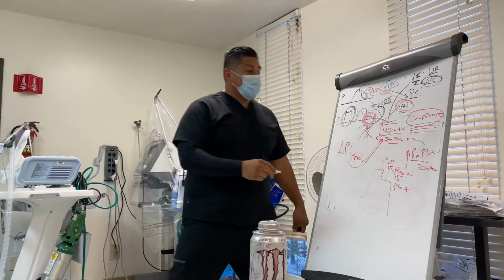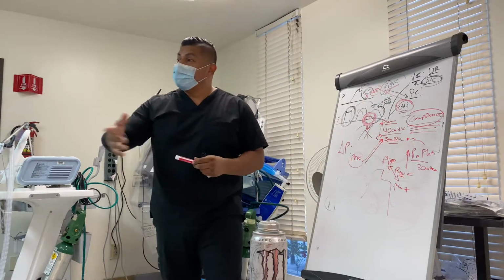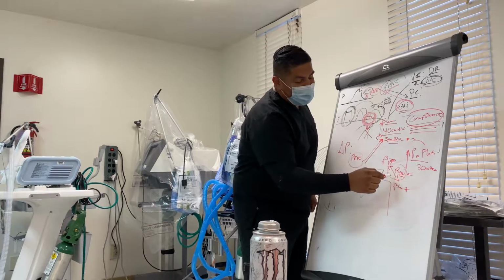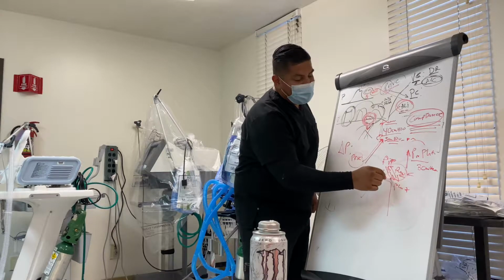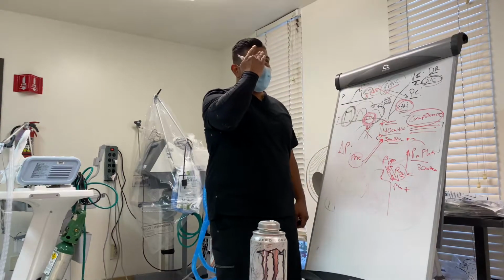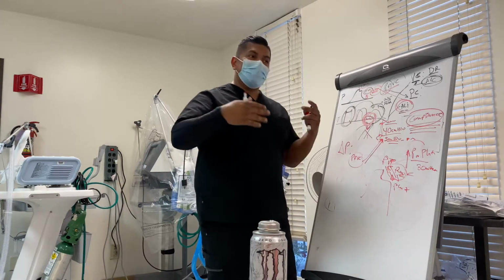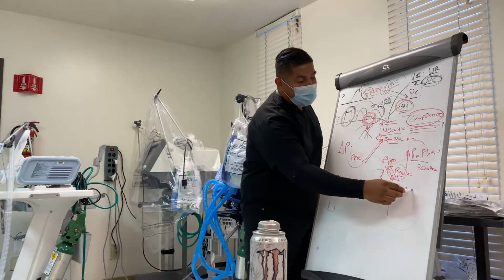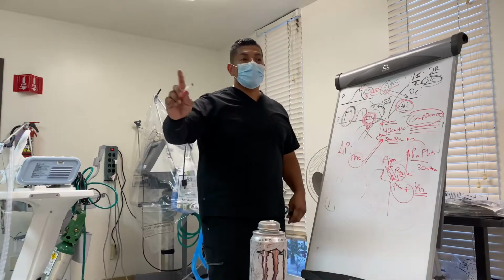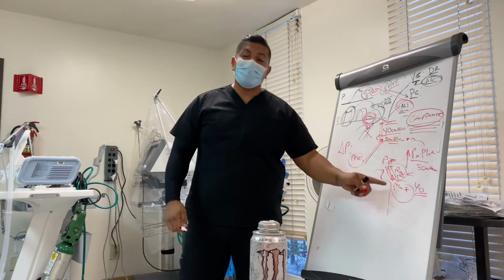This is why whenever your peak pressure goes off, what's the first thing that we do? Suction. Because secretions can cause resistance in flow delivery. So we try to minimize this. But you suction, patients still peak pressuring. You give a treatment, patients still peak pressuring. You measure the plateau pressure and you notice it's at 40. It's not secretions, it's not bronchospasms, it is the alveoli itself.